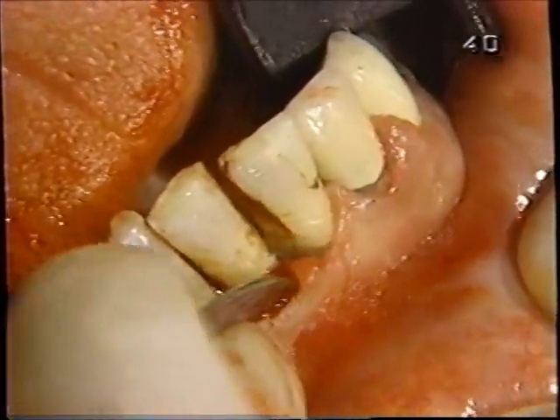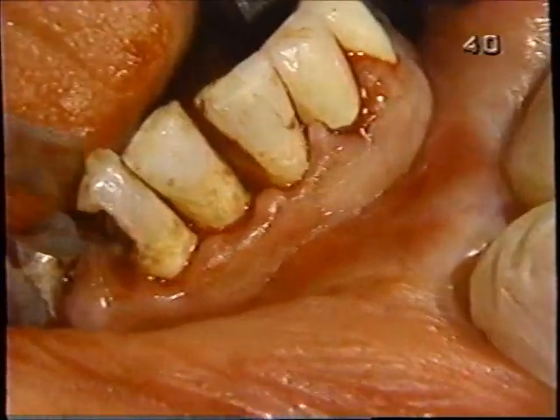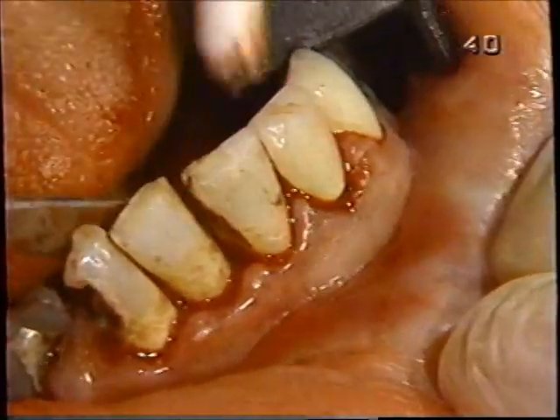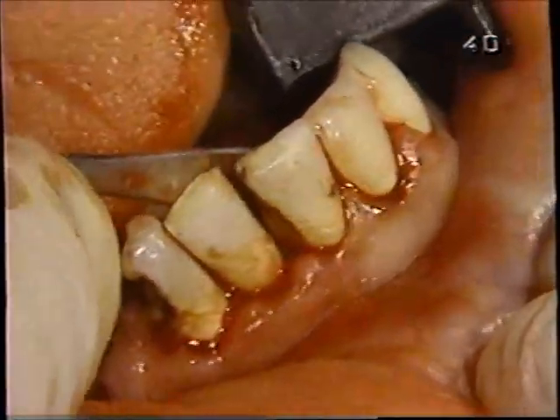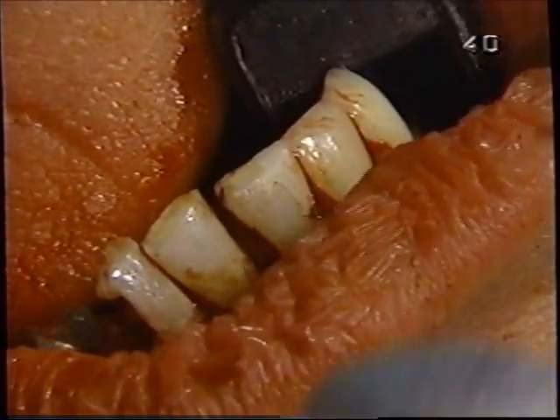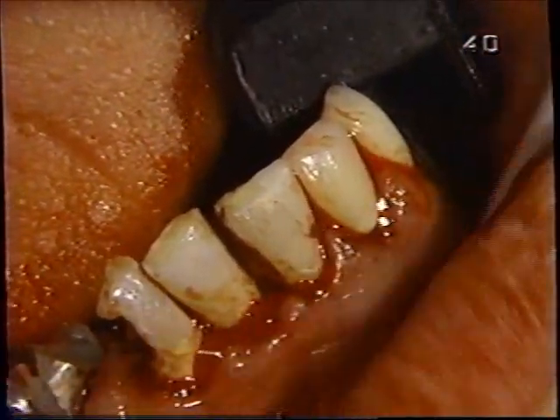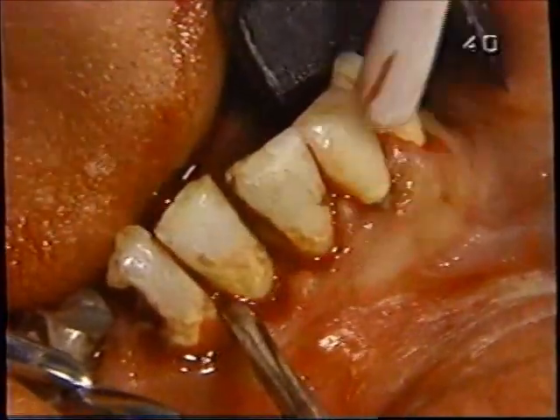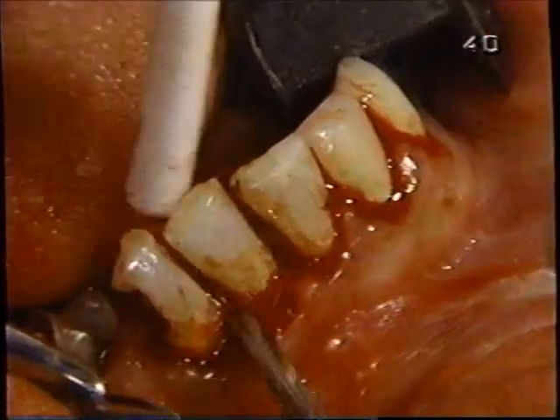You know, this patient probably should have had scaling with the cavitron. That didn't happen. It's okay. Would have been a little bit nicer. We just have to make sure that none of the calculus that I can see ends up staying in a socket. Now in this case, as we luxate, we don't care so much what moves, as long as it's not number 28 there. So if we luxate both of them, so much the better.